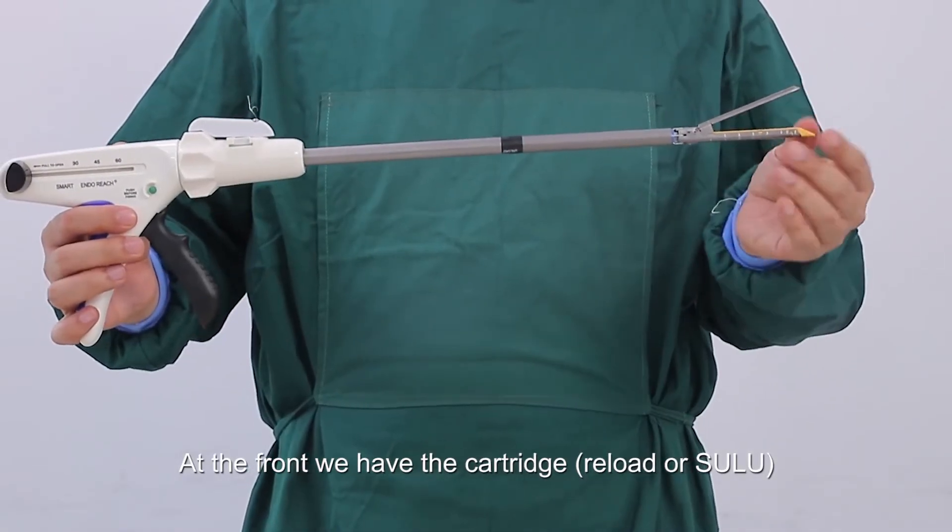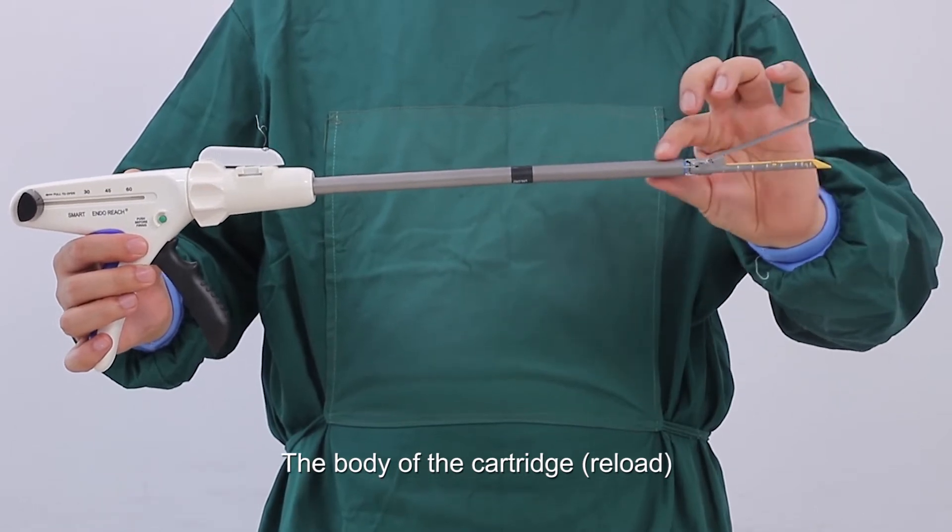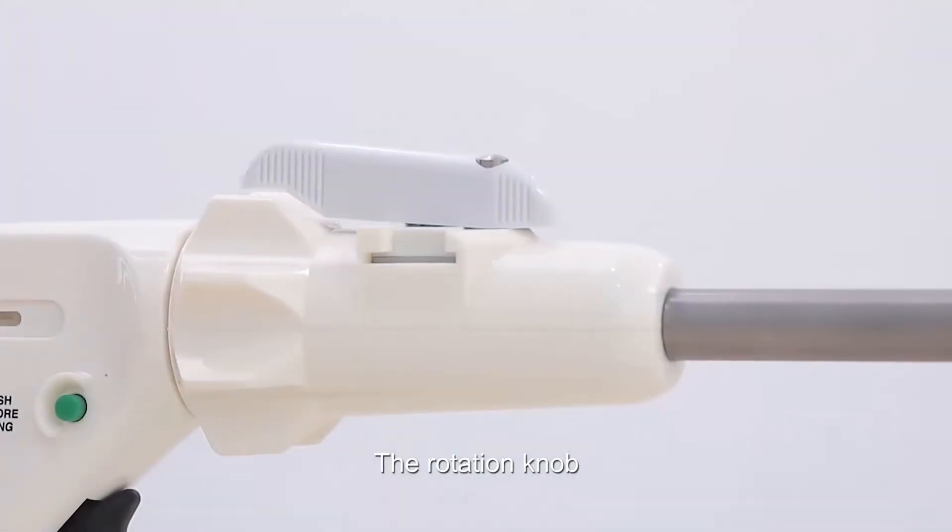At the front we have the cartridge and the cartridge housing, the anvil, the body of the cartridge, and the rotation knob.